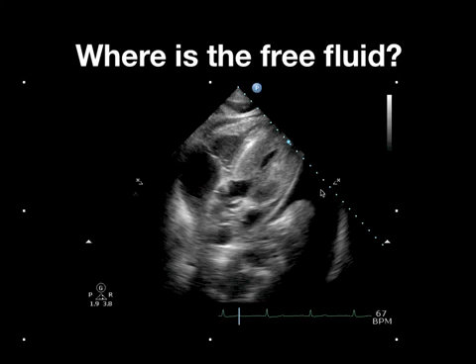This is actually a patient that had a large left-sided pleural effusion, and here you can see the lung, in this area right here. So this patient has pericardial effusion here, intra-abdominal or intraperitoneal free fluid, and a left pleural effusion. So there's different spaces in which fluid can be detected on this subcostal window, and you really have to look at what the shape of that container is that the fluid is within.